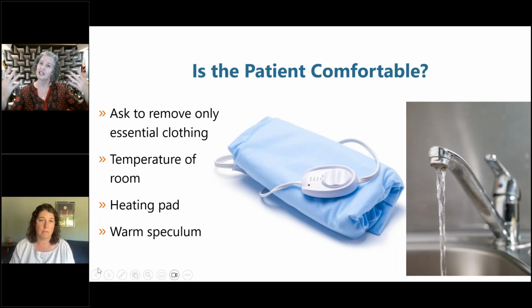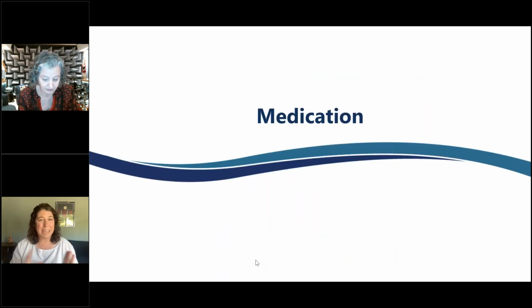Just like we like to wash our hands in front of the patient so that they know we've done it before we see them, it's also really nice to run the water, have it be warm, and have them see we're taking the minute to warm the speculum. And even if you can't do that, while you're chatting you can put on a glove and hold the speculum in your hand so that it at least warms up a little bit and it's not just chilly.